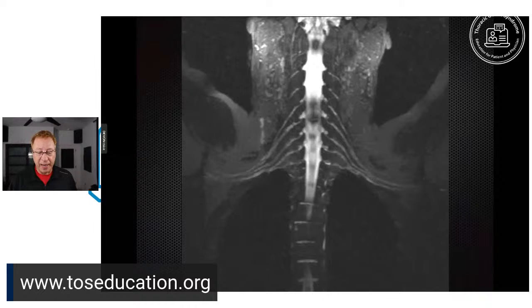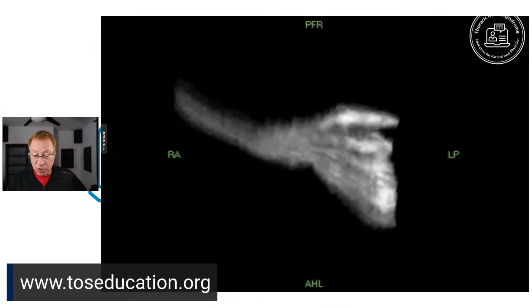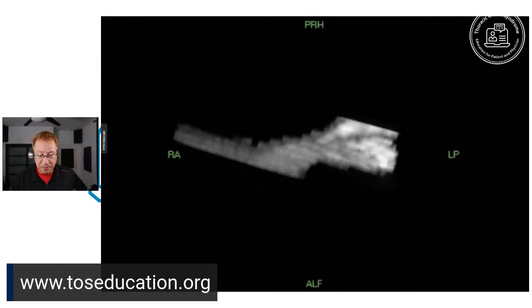Here's a picture you can't get with any other study like a CT or an ultrasound that we showed. This is part of the spinal cord. These are the pieces and components of the brachial plexus on each side. You can see them all beautifully laid out as they come out from the spinal cord and the spinal canal, and they head out into each shoulder. You can take these and you can do all kinds of fun stuff. This is a picture of a brachial plexus, just the right-sided brachial plexus by itself.